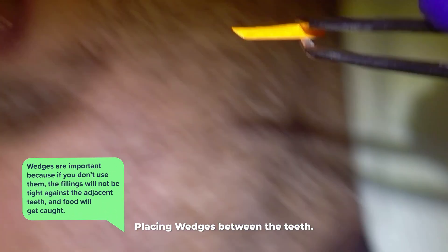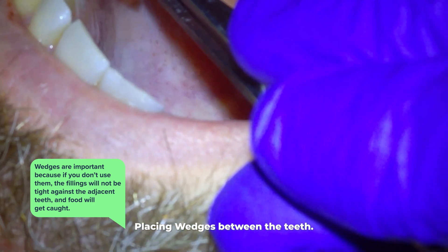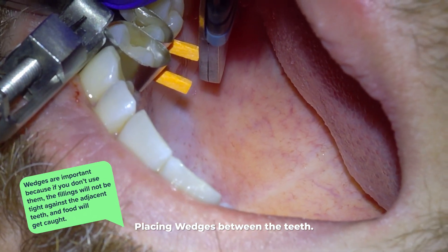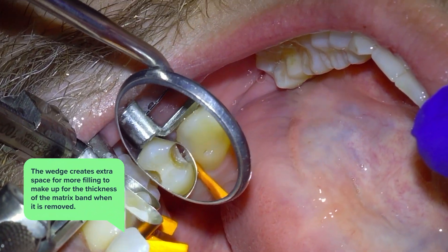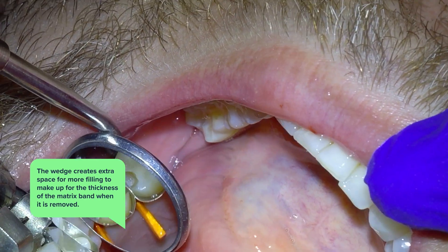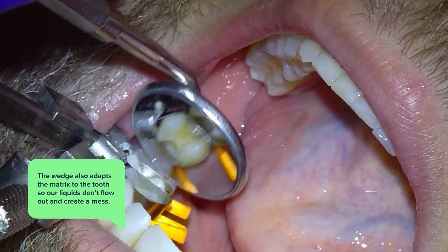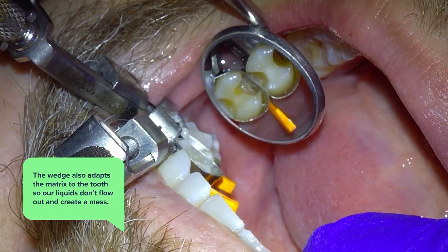After the matrix is down, we place wedges in between the teeth. Wedges are important because without them the fillings will not be tight against the adjacent teeth and food will get caught. The wedge creates extra space for more filling to make up for the thickness of the matrix band when it's removed. It also adapts the matrix to the tooth so our liquids don't flow out.